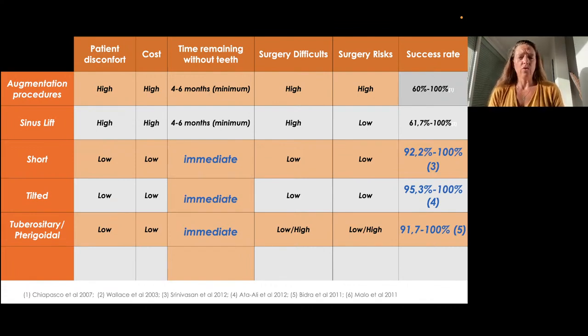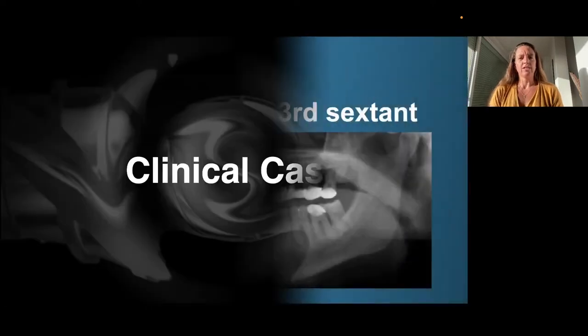So of course, it's already a little bit more demanding in terms of the surgery compared to the tilted implants that you have in the maxilla, but it also has low surgery risks. So this is one of the cases.